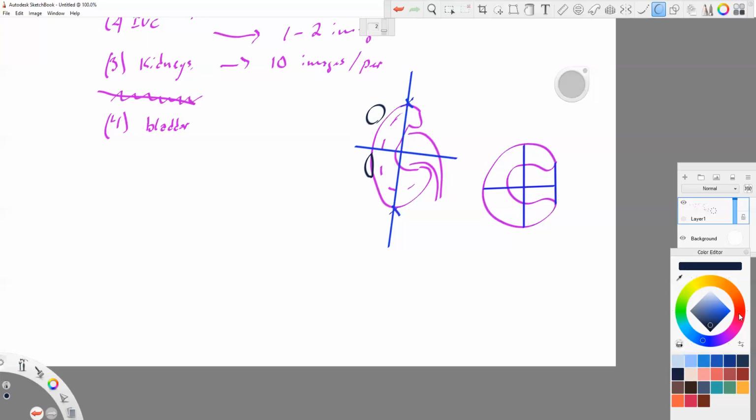So once again, red line. I forgot this. That's one color, and go back. So actually here, green line will be, I'm scanning out to here, and I'm scanning out to here, and I'm catching, I'm saying, oh, there's a cyst. Well, now that I see a cyst, my first image is going to be outside of the kidney because there's a cyst there. I got to take that picture, and I'm doing the sagittal images here.